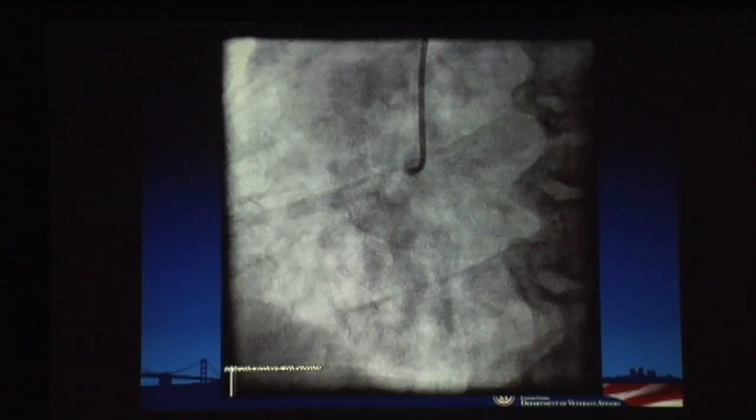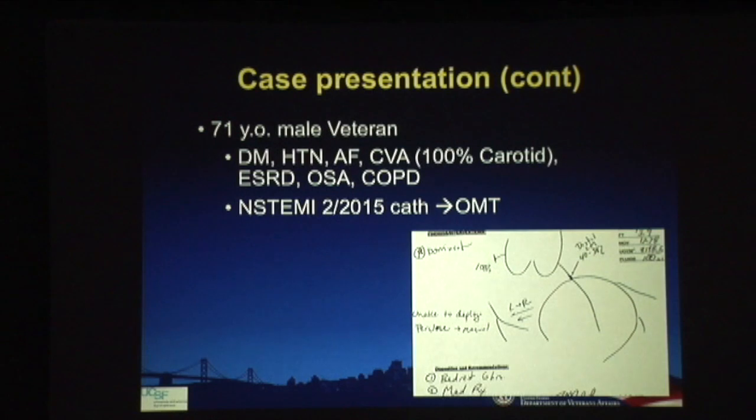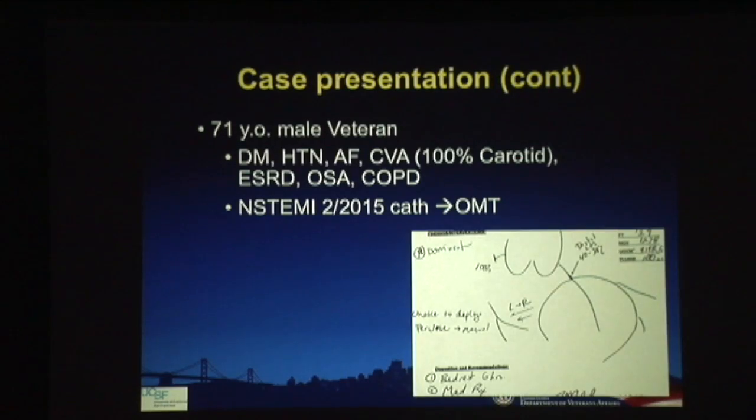And the right coronary, as we suspected from the presence of collaterals, was occluded. So we have an indeterminate left main with an occluded right coronary. So again, there's the sketch drawing that was done by the team at the time that did the cath, and they decided to call that a 40 to 50% left main, sort of the hedge right in between, with occluded right, and decided to do optimal medical therapy for this guy who was high risk for surgery.